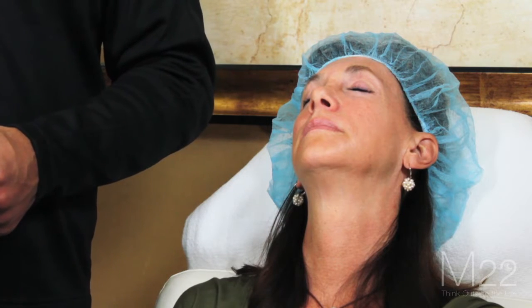The patient is going to feel some heat and it may feel like a little rubber band on the skin. The first thing we're going to do is put these little shields on. If you were to treat a patient without doing the eye shield and that light were to go on the iris, the light would be absorbed by the iris and that could give you transillumination defects and inflammation in the eye.